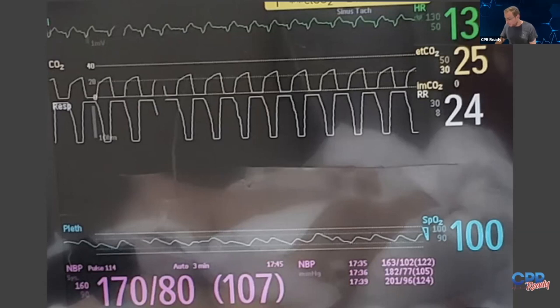And I have a 911 Cast podcast episode all about respiratory rate. It's one of the most sensitive vital signs that we tend to make up, right? Everybody's got a respiratory rate of 18. Shark fin, high respiratory rate, low end-tidal CO2 because of it. This is a patient that truly is having significant bronchospasm and needs intervention. They need treatment for it. And as this patient gets treated, this will all start to normalize. And this shark fin is going to start to look more and more normal.